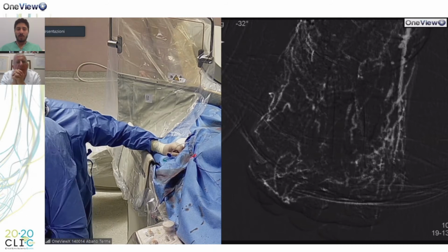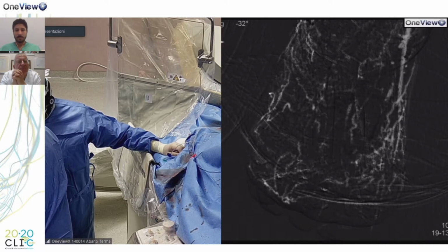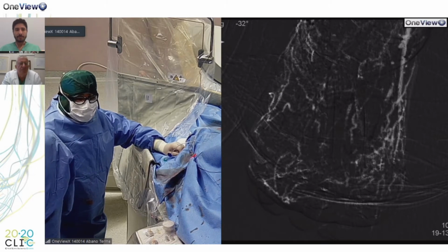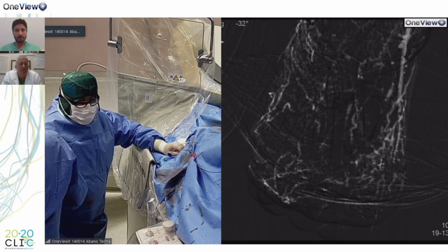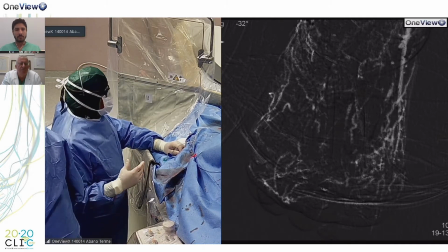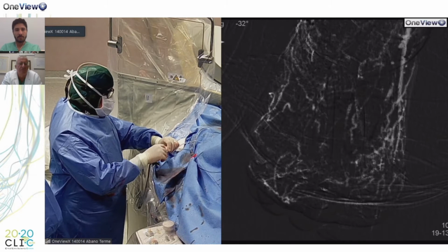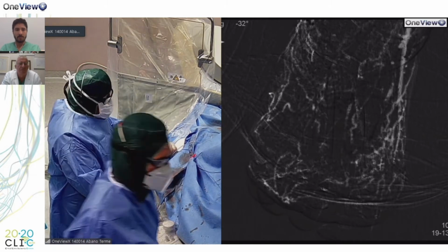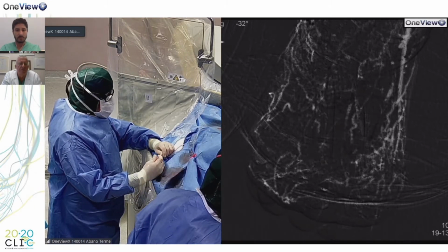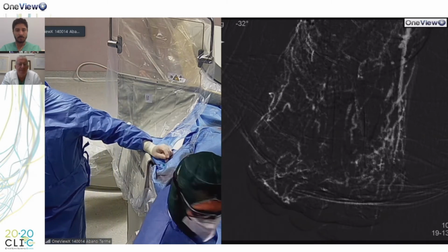Marco, can you tell us something about the guide wire you are going to deploy for jet stream? Yes, because we have to use a rotational atherectomy device, of course, we have to avoid all the wires with hydrophilic coverage, and all the wires where there is a danger to lose the coverage and the tip. So we have to avoid long tip and hydrophilic wire.